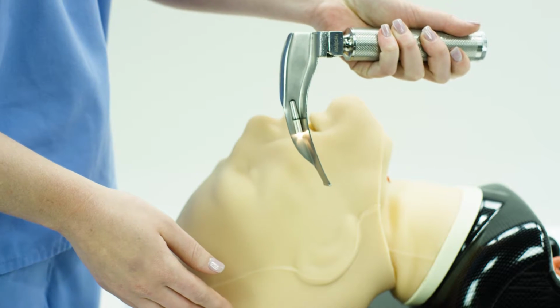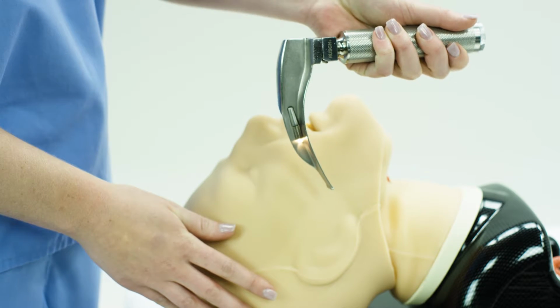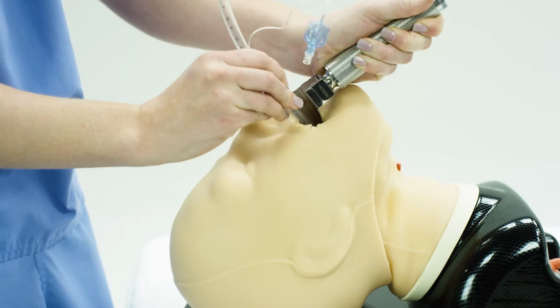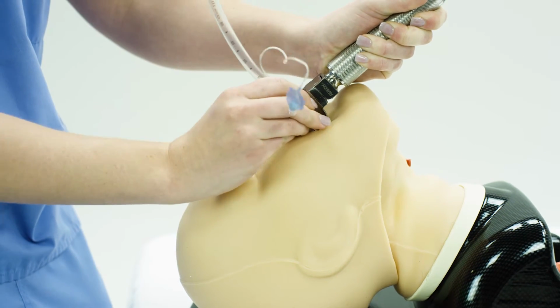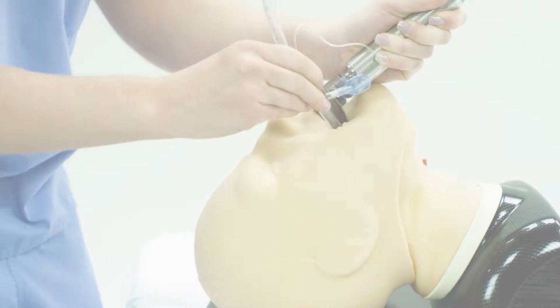However, there are disadvantages of this laryngoscope design, including the light source being placed towards the tip of the blade, which can be easily obstructed by blood, vomit, and other secretions. The fact that the blade is curved and open does not allow the user to have a straight line of sight view of the vocal cords. The blade is also open and cannot stop blood or soft tissue such as the tongue getting into the user's way and making visualization of the vocal cords more difficult. Lastly, the user attempts to use the endotracheal tube to intubate immediately with this blade. This is a large, unwieldy plastic tube that can be difficult to insert in any case.